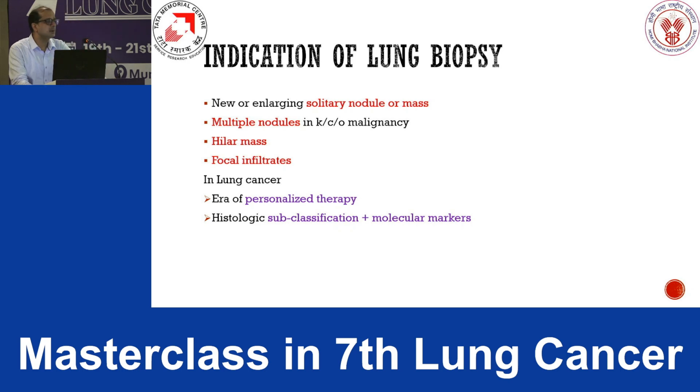Coming to the indications for lung biopsy, either we need to target a solitary pulmonary nodule or a mass, or multiple nodules in case of malignancy to prove it's malignant or metastatic. And for NGS workup, for hilar masses, focal infiltrates, if we are suspecting infective etiology if the patient is on chemotherapy, that's where we need to target.